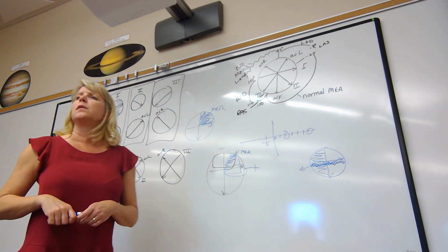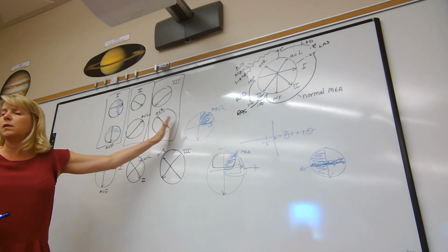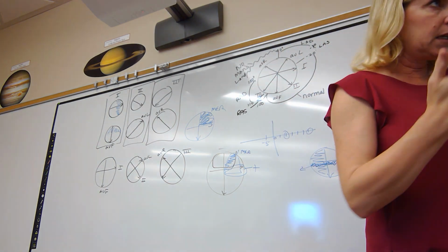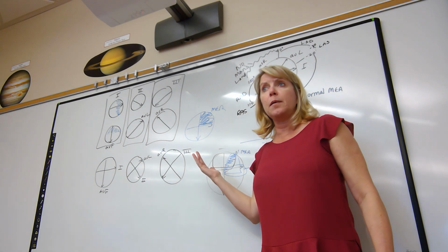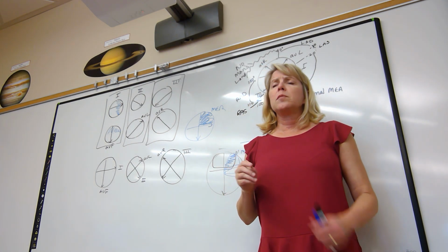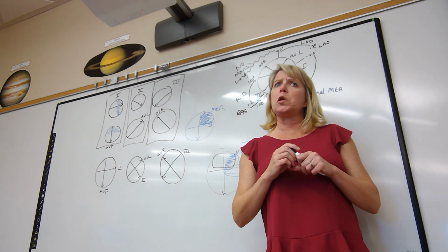So some of you, depending on the look, these are the only 3 combinations I will give you. I will tell you the MEA of the patient. It will be an RAD or an LAD. Clear? Okay, so if you play with these 3 possible combinations and play with an RAD or an LAD, some of you who are doing your job right might say, Kara, I could see possibly 2 potential answers for some of these.